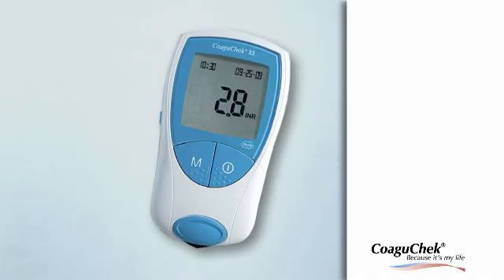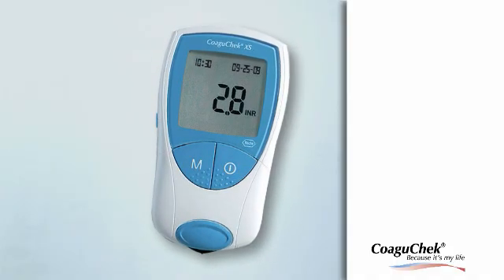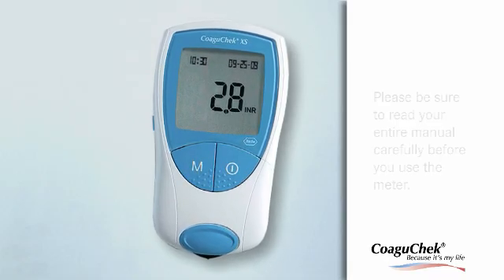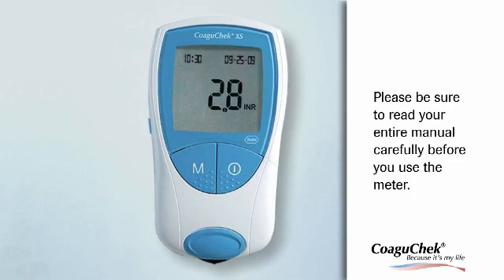The CoaguCheck XS system offers a simple, convenient, and safe way of INR self-monitoring. This video guide will show you how to use the meter properly. Please be sure to read your entire manual carefully before you use the meter.